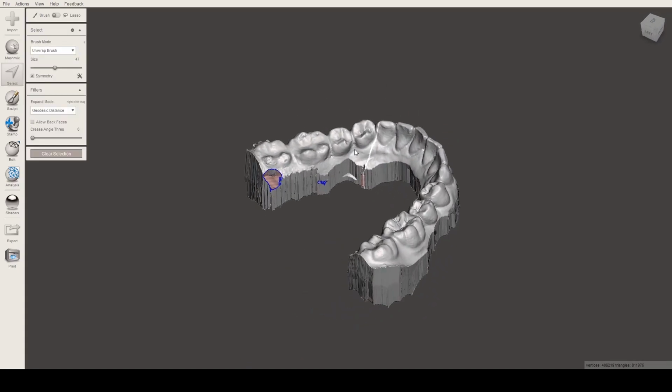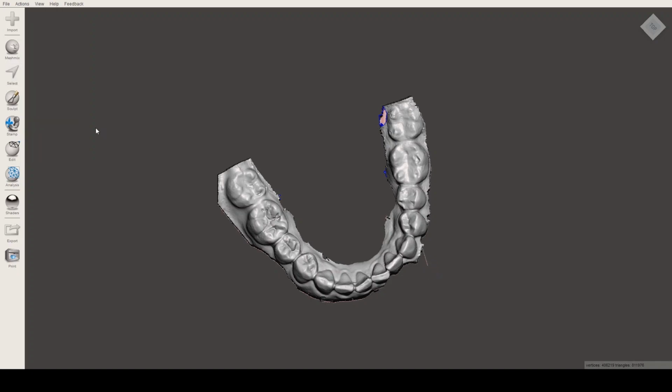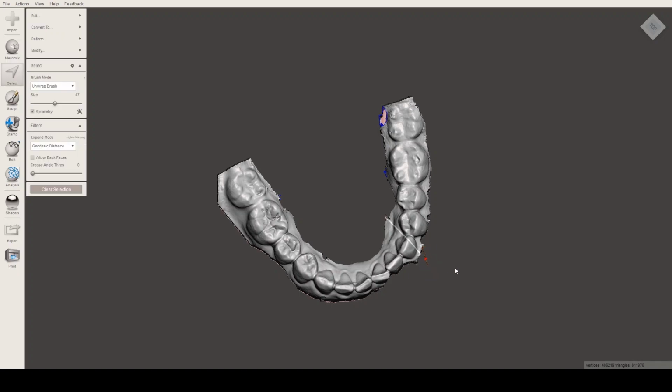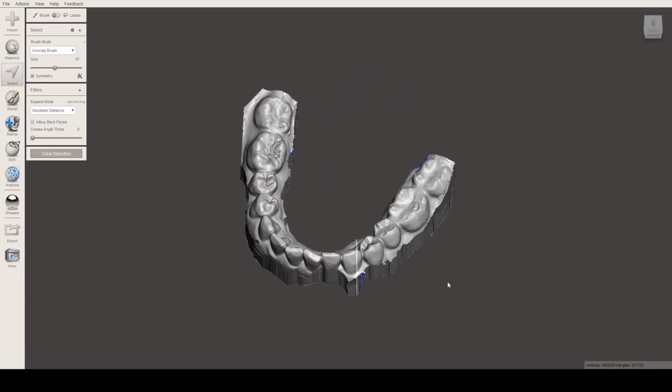So let's select those pointy things that we don't want in our model. We got holes. Actually, let's fix that later. I'm gonna teach you a trick with Meshmixer that fixes holes as well. And let's actually make our holes bigger, or let's make more holes. Okay, I'll select this. Why is X not working? There you go.